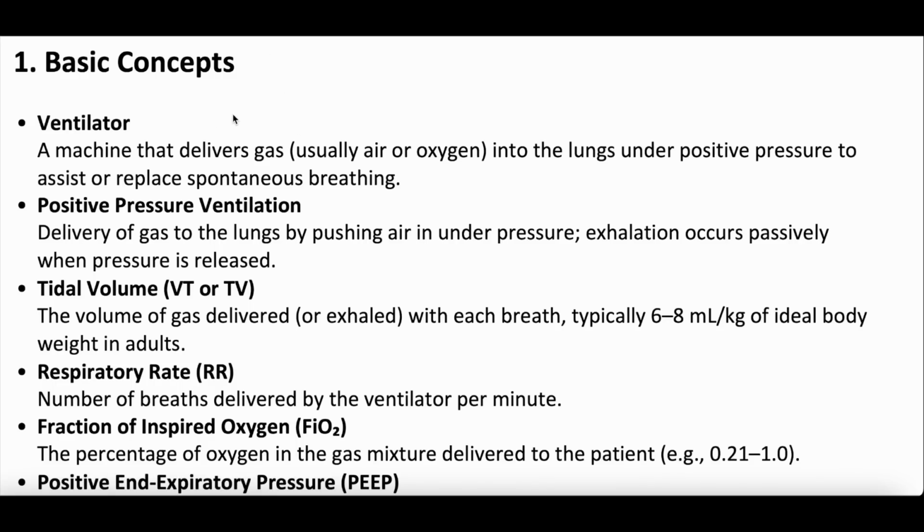So a ventilator, what is a ventilator? I think all of us inherently know what that might mean, but to spell it out, a ventilator is the actual machine that is delivering the gas to the lungs, and it's under positive pressure. And this is a machine that isn't ever intended to fix the lungs. It's intended to give them time to heal from whatever their primary injury mechanism is.